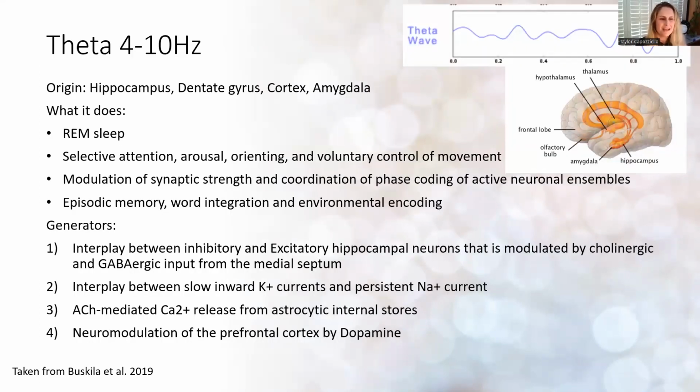Oh, I thought that I was going to be able to go over showing what it looks like, but we'll actually look at it in the spectral, where we can see it, once again, looking like delta. And we want to make sure that if we see that, we can go back and look: is this a sleep vertex, K complex, or is it actually delta at the midline? So once again, when we see it in the spectral, we want to go back and know what we're seeing and why.